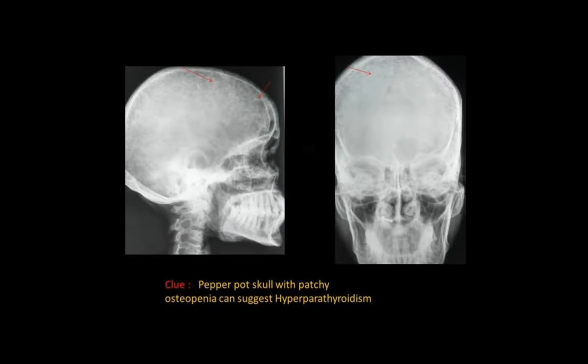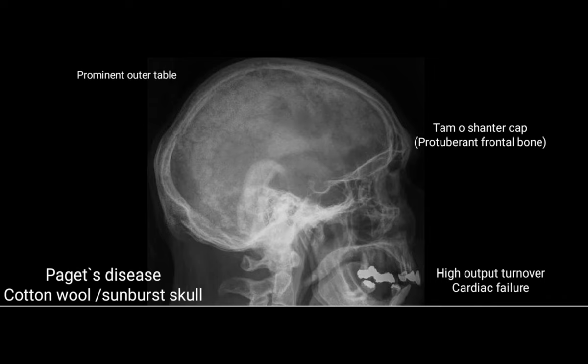This is an image of Paget's disease. In Paget's disease there will be a cotton wool or sunburst skull appearance — small lobes like cotton placed over the skull. The outer table will be more prominent, and the frontal bone is protuberant, known as tam-o'-shanter cap. It results in high-output cardiac failure.